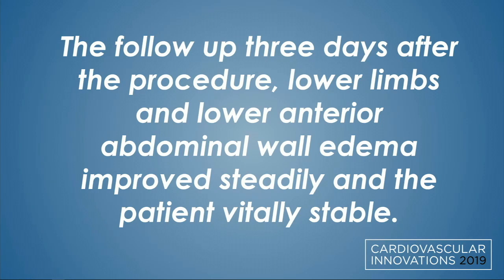But unfortunately, in our institution not all sizes are available. So in this case we are using 16 millimeter by 60 millimeter. We could use a longer stent for crossing, but it's not available. So we are using two stents, with a very short gap between them, to cover the whole IVC.